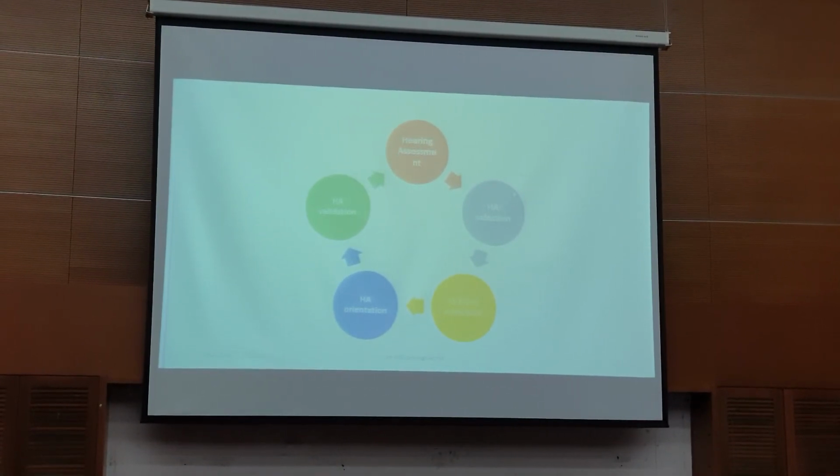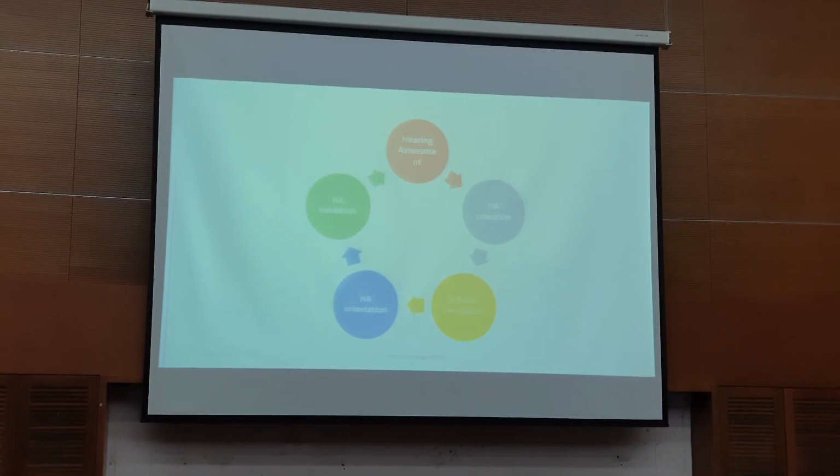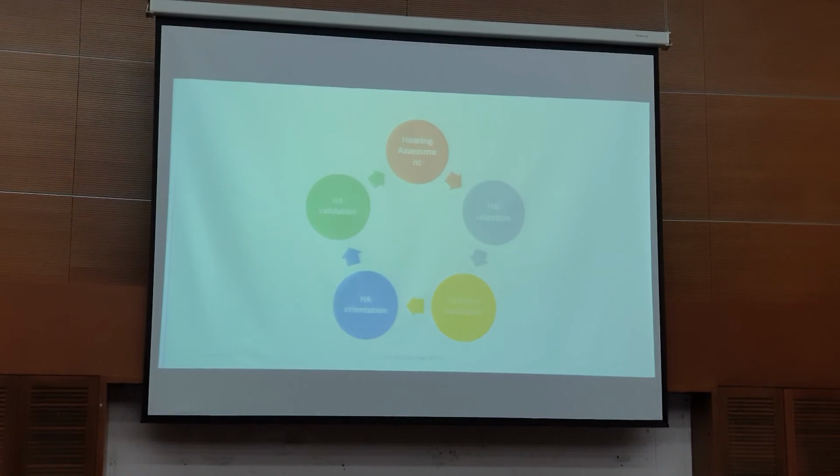So dalam kita punya hearing aid selection, ada a lot of things our students need to know when they select hearing aids. And then fitting, kita ada verification. Verification is when we do real ear measurements. Real ear measurements is when we actually measure near to the eardrum tu. Kita ada masukkan tubing kat dalam tu, and we measure the output at the eardrum. We really want to know macam mana hearing aid ni function at the eardrum, the signal at the eardrum, because we don't want over amplify.